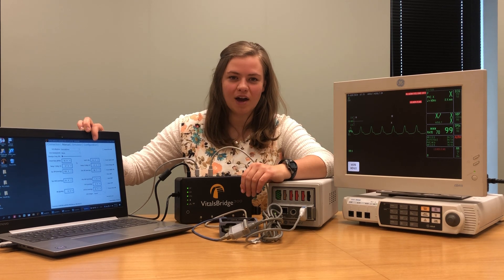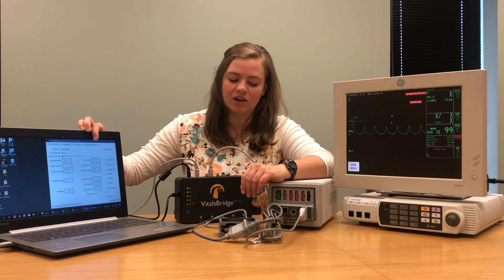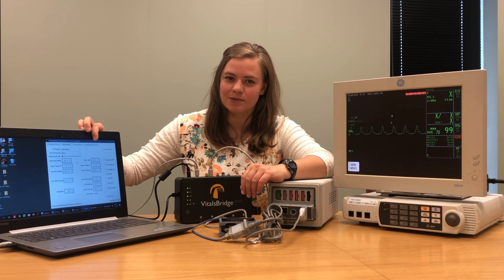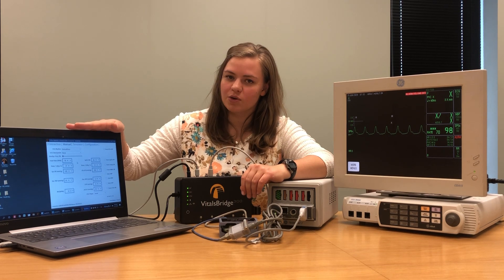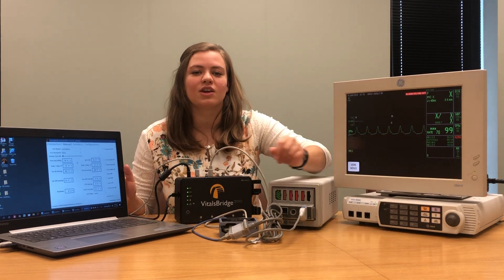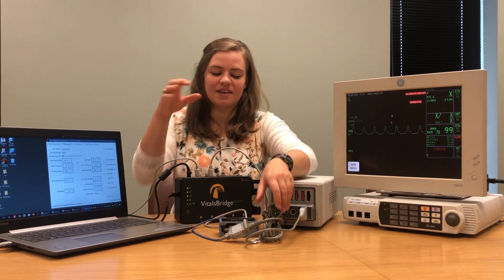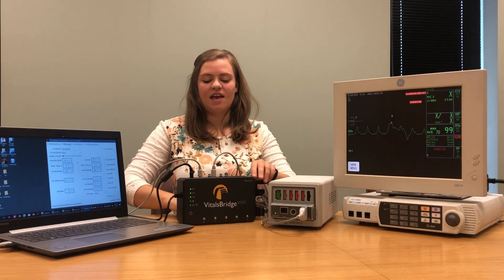Come up to the configuration tab in your connector software and perform an SPO2 calibration that's specific to your patient monitor. I'm not going to show you how to perform that calibration today but instructions can be found on VitalsBridge.com/downloads. Once you have that signal calibrated, the number that you input into your connector software should perfectly match the SPO2 saturation level that you see on your patient monitor. We're going to move this aside and start on the next vital sign.